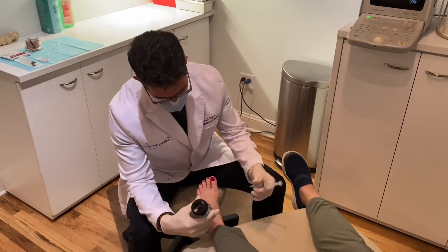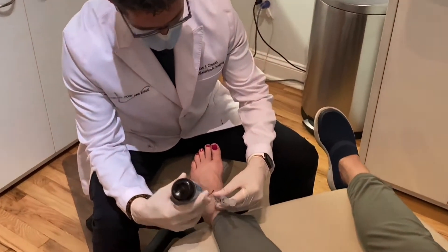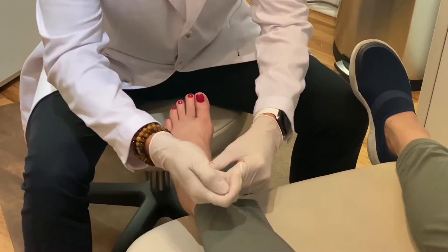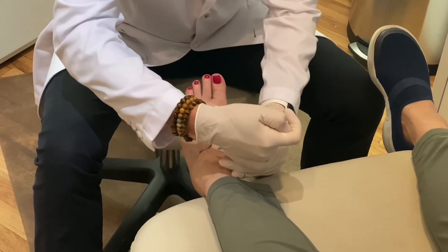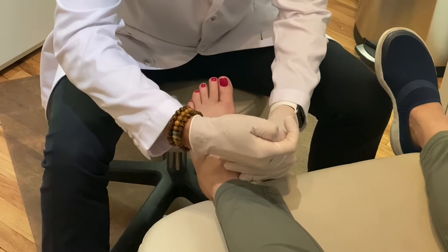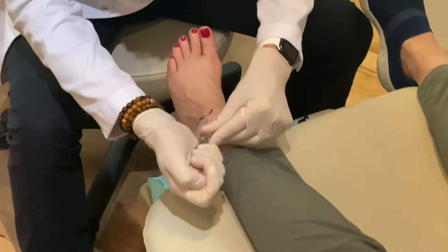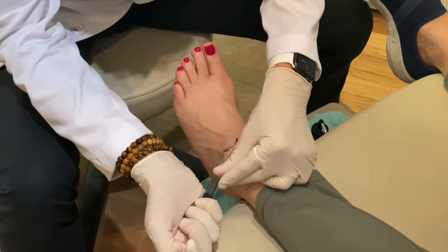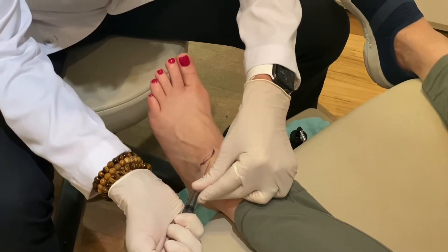You're going to feel some freezing, so try not to move your foot as you get a little pinch. You felt that? It was nothing. And then you're going to feel some burning and it's going to feel like it's moving towards the outside of your foot. And it's going to feel like it's moving towards the inside of your foot now. That's not fun, I know. Almost done.